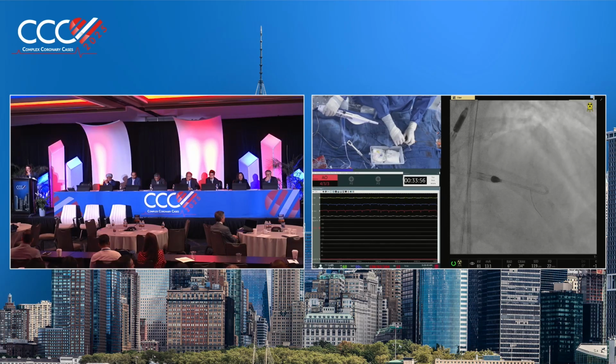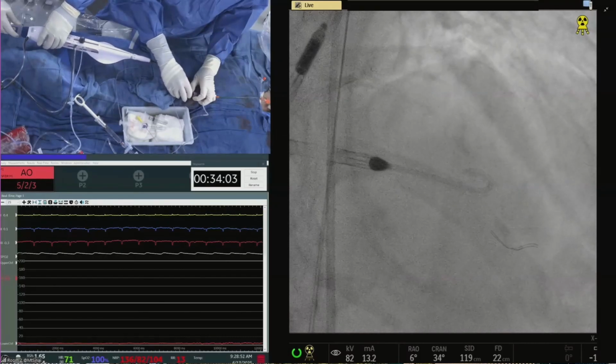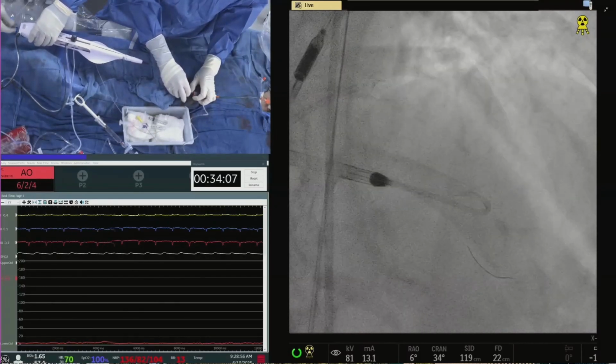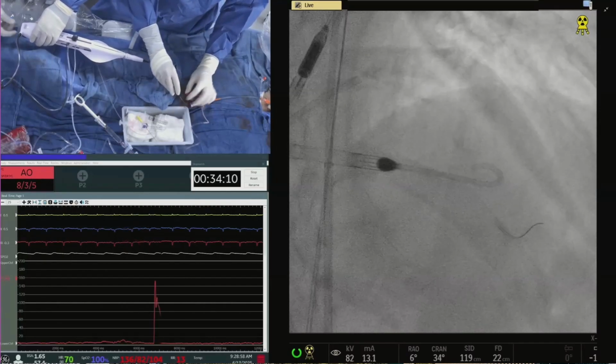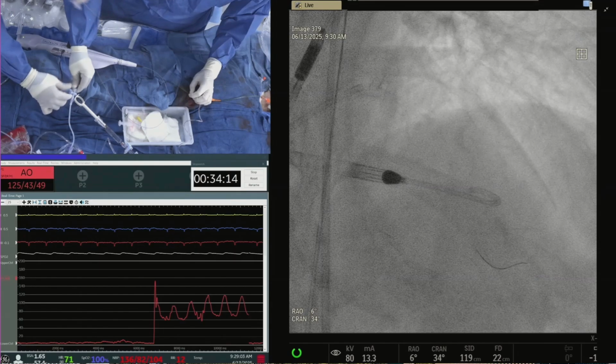Okay, Dr. Kinney, tell us, we see you're taking your rota out. What's next? We could not complete that second lesion. We already finished 2 minutes, 30 seconds of burring. Now the question is, should we have gone to 190? I did not.